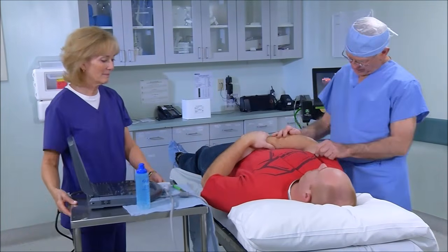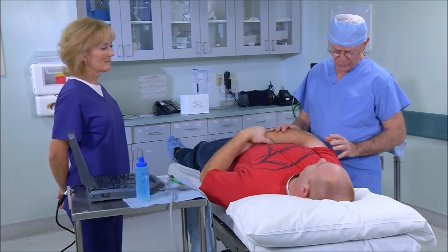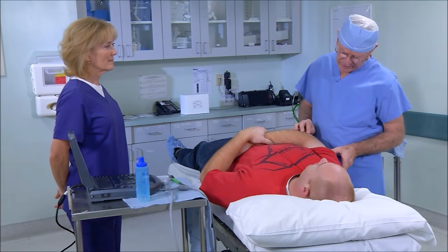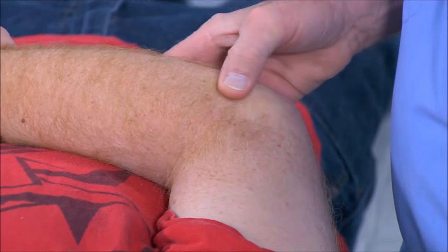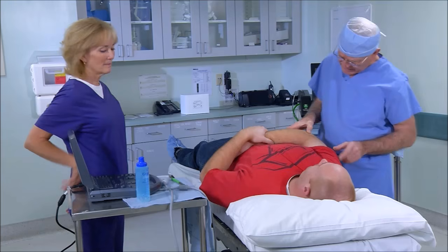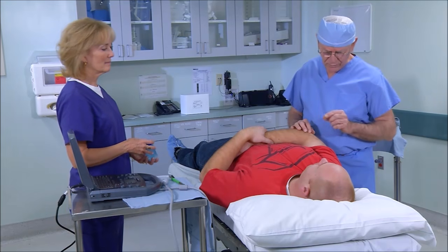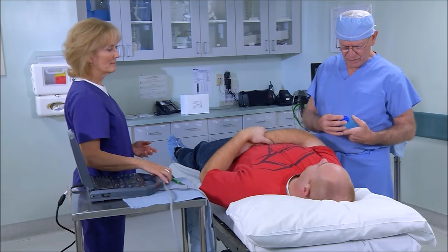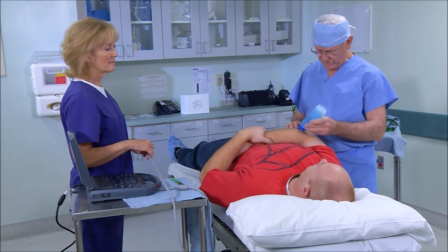So, how you doing? Good. Okay. Well, I'll tell you everything we're going to do. The first step is I want to just confirm where the problem is. So I'm going to poke around and you tell me when I hit that area that we found in the clinic that bothers you the most. Right there. Right here? Yeah. Now the next step is I'm going to take a look at it with the ultrasound. I'm going to make sure that we can see the extent of the problem, and that way we're more confident that we can treat it all and get rid of the pain for you.